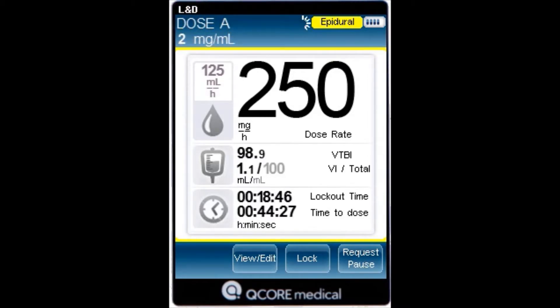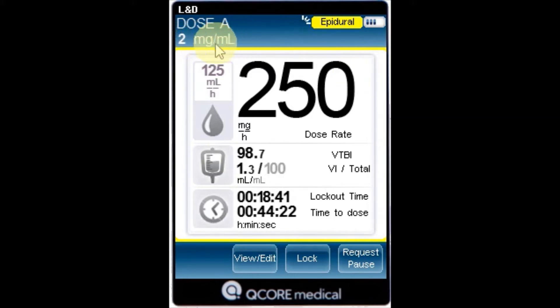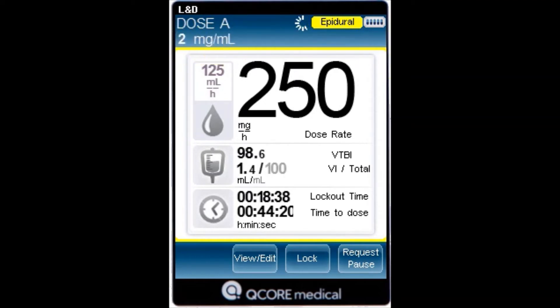The drug concentration — the drug concentration as entered by the user, final concentration, or drug amount over diluent volume, is displayed when applicable.